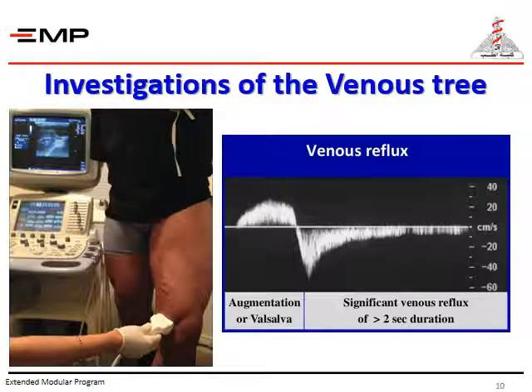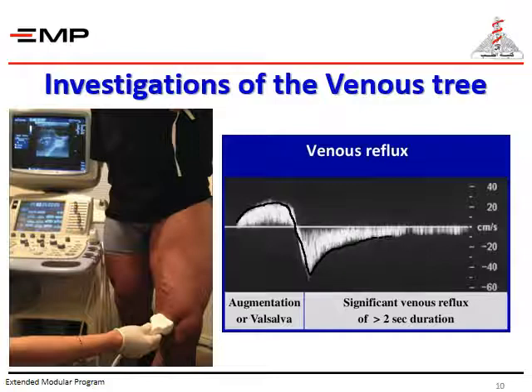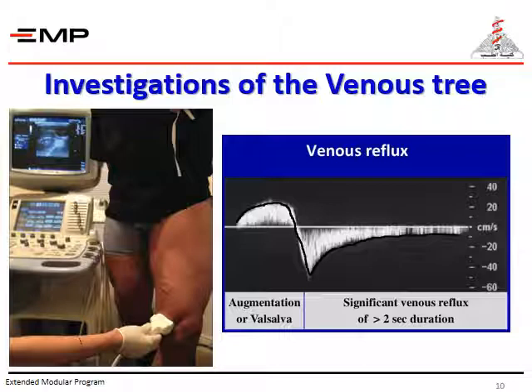You can see here the normal venous waveform, and here is the refluxing veins against the direction of flow — that is a reverse flow that is sustained and maintained for a long time. This is visualized within the venous duplex, and you can trace these graphs and document venous reflux beside the voice or sound of venous reflux. We will demonstrate how this happens and how to use your pocket Doppler to detect venous reflux in your face-to-face sessions.